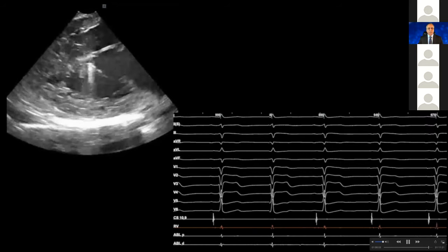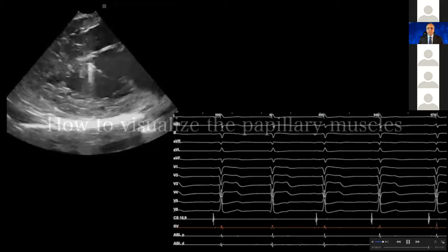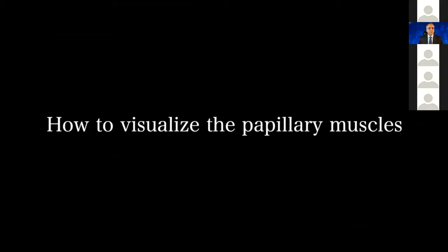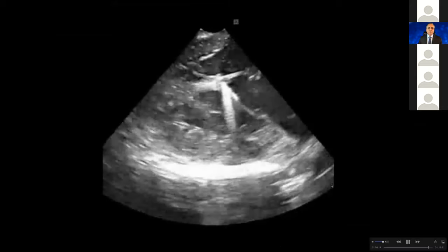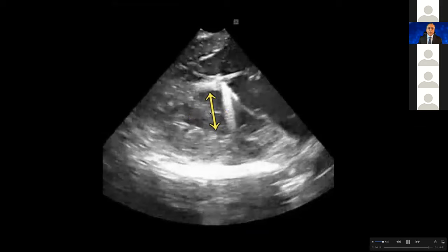You can see the ablation catheter here is very early, and as soon as we started burning you can see the bigeminy went away and the PVC disappeared when it was eliminated. For visualizing the papillary muscles: if you clock your eyes you're going to always see the anterolateral papillary muscle, and you know there is a distance between that papillary muscle and the posterior wall — it is not sitting on the posterior wall.